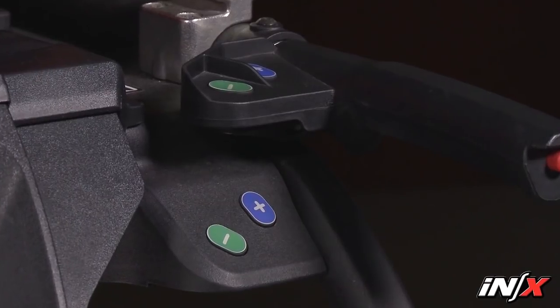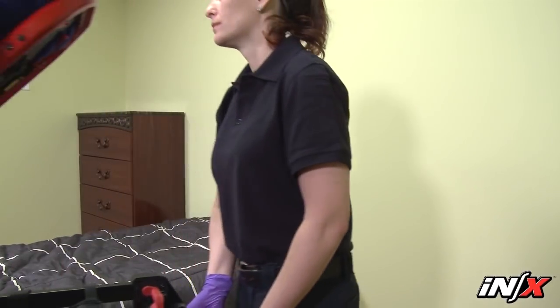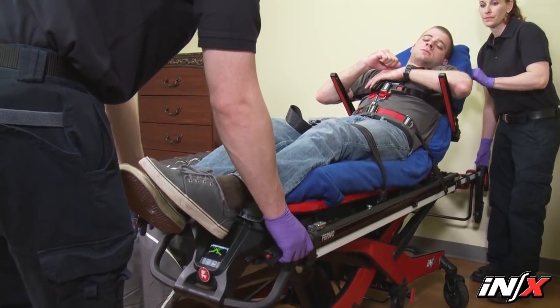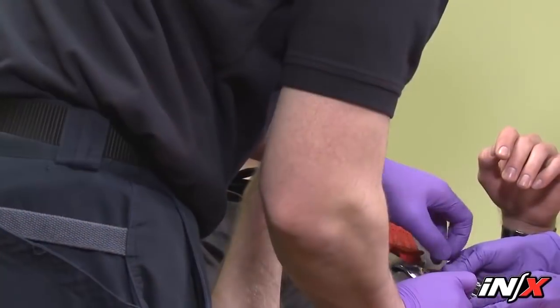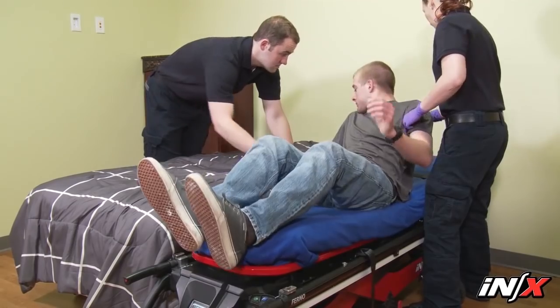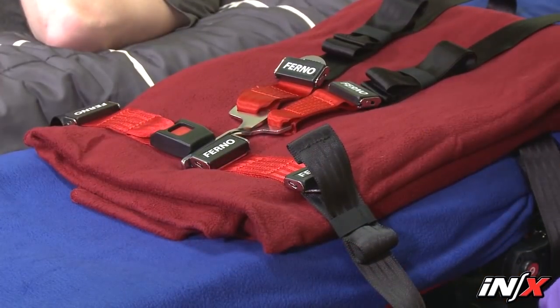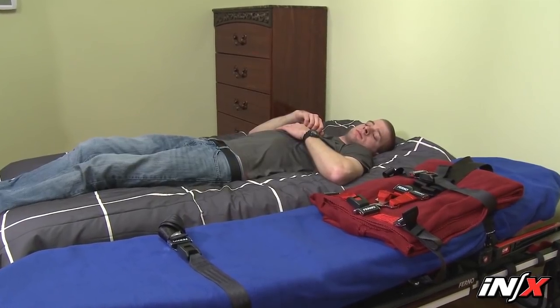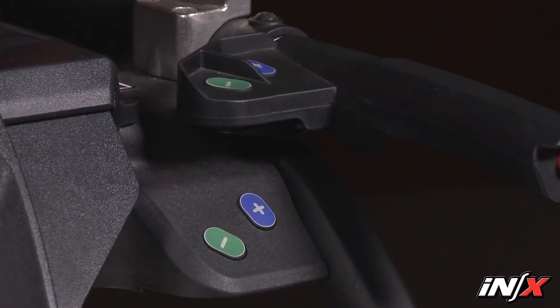To transfer a patient onto the NX, unfasten the patient restraints and arrange the straps so they won't interfere with the transfer. If needed, rotate the side arms out of the way. Place the NX beside the patient and press the plus extend or minus retract button to adjust to the patient's level. Lock the wheels. Transfer the patient onto the NX using approved EMS procedures and following your local protocols. Adjust the backrest, shock frame, and restraint length as needed. Fasten and adjust the patient restraints. Before moving the NX, make sure sheets and other articles will not interfere with its operation. Unlock the wheel locks and press the plus extend or minus retract button until the NX reaches the factory set transport height. To transfer a patient off the NX, roll the NX near the destination surface and adjust the NX to or slightly above the destination surface, then lock the wheels. Rotate the side arm out of the way, unfasten the patient restraints, and arrange the straps so they won't interfere. Transfer the patient onto the destination surface using approved emergency medical procedures and following local protocols.